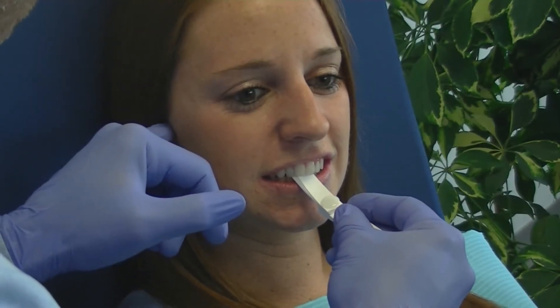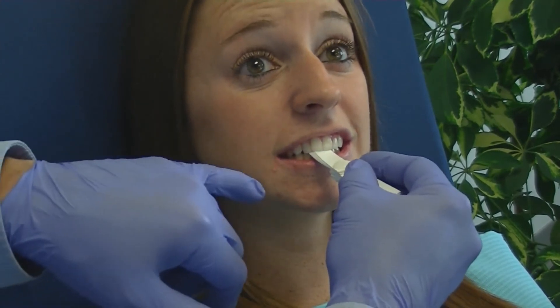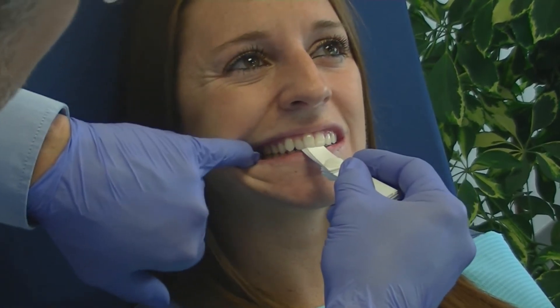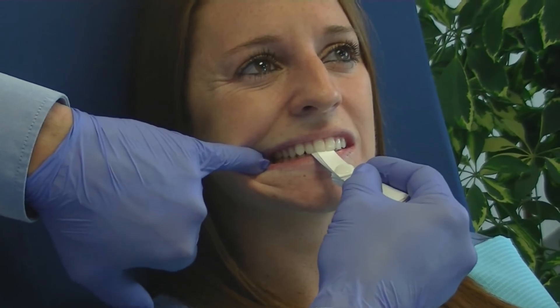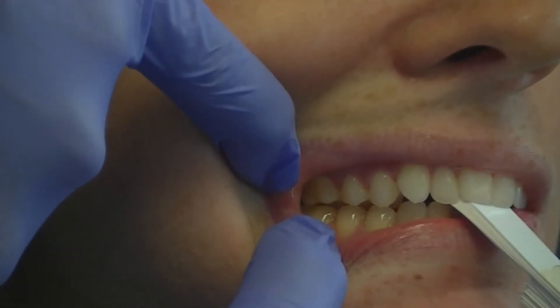Trial for the leaf gauge by estimating the proper number of leaves required to achieve the necessary clearance at the molar region. Lab requirements are at least 1.5 mm at the molar cusp region. Add or remove leaves as necessary.